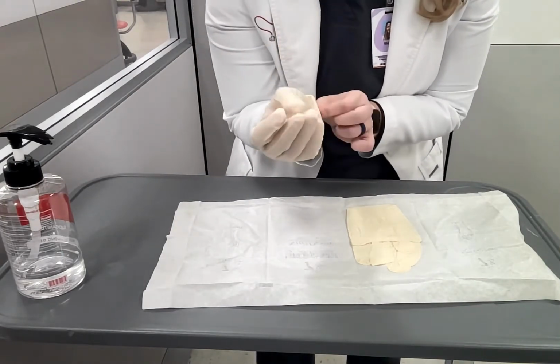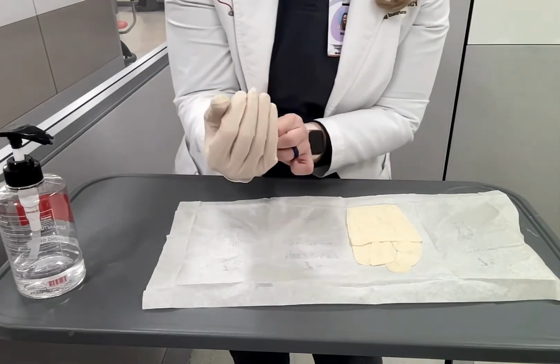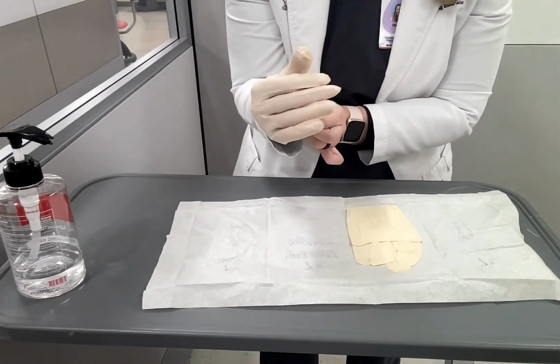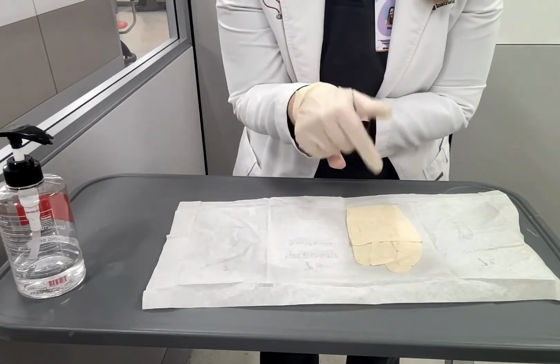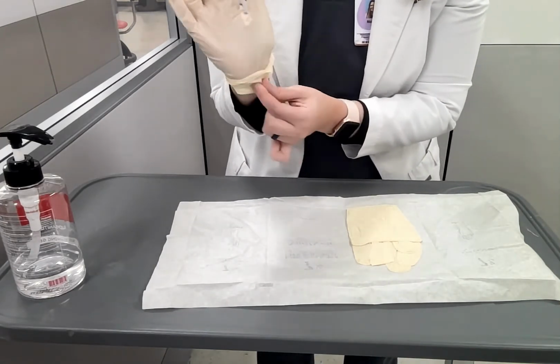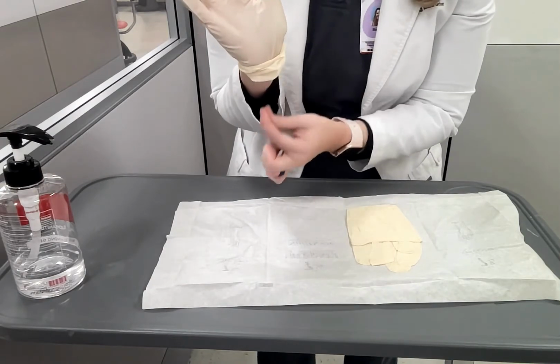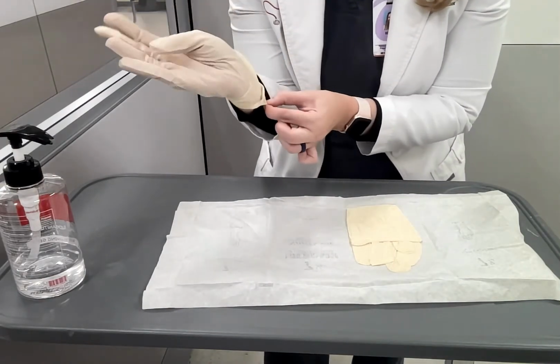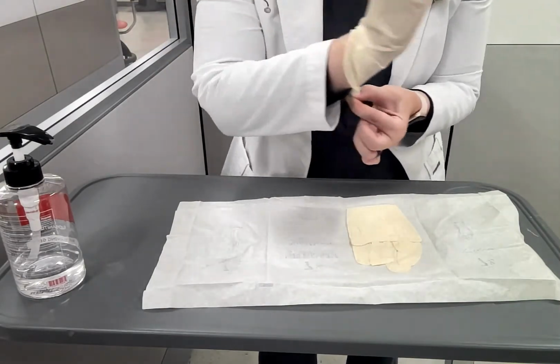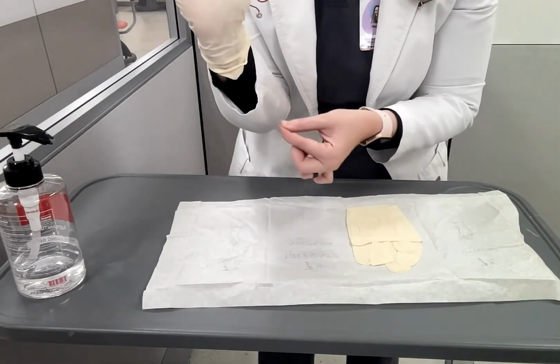I don't want to fix or fuss with this glove. If I accidentally got 2 fingers inside 1 finger hole, leave it be. You can fix it after your second pair is on. Do not pull down or touch anything on the sterile part. Grab this and you can tug it down a little bit if you want. That's as far as it gets. Okay?